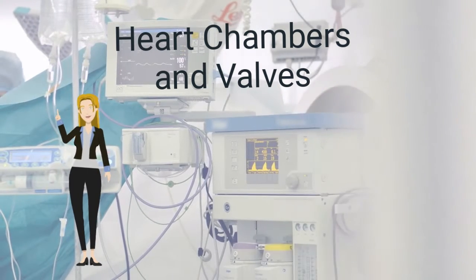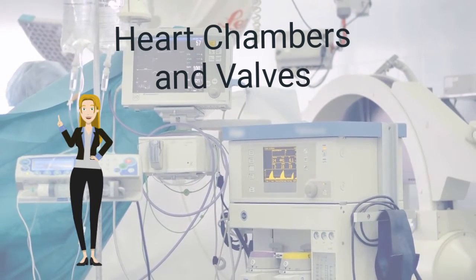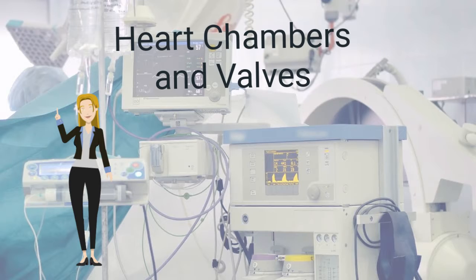Sometimes a cardiac catheterization is done without coronary angiography. It is performed for physicians to look for problems within the heart chambers and valves, as well as to take measurements of different pressures in different chambers of the heart. These measurements give insight into different disease processes.